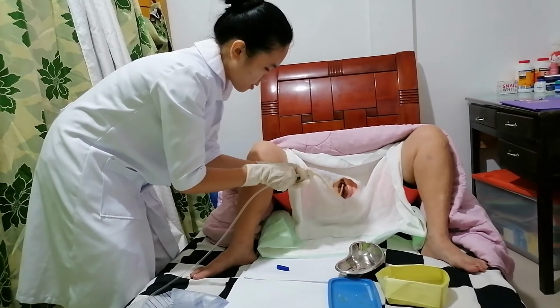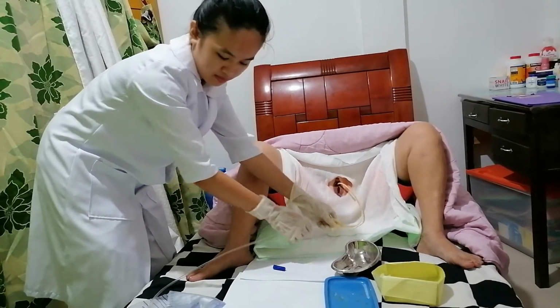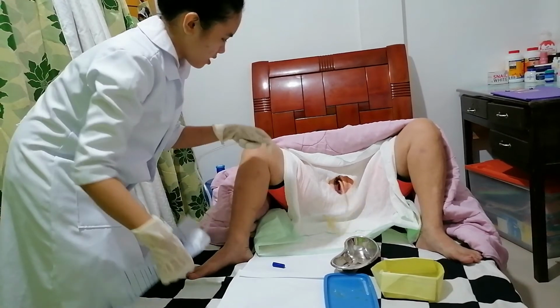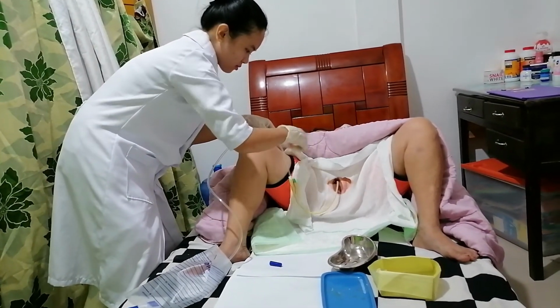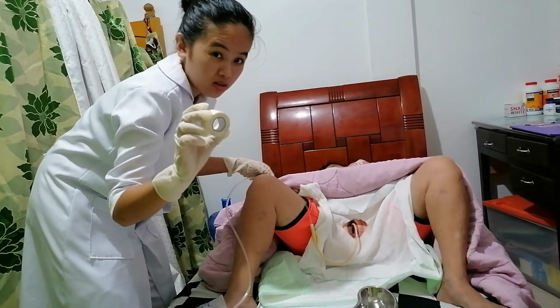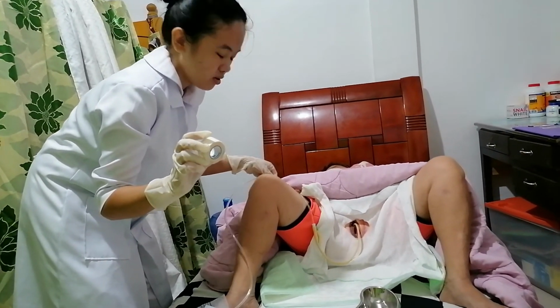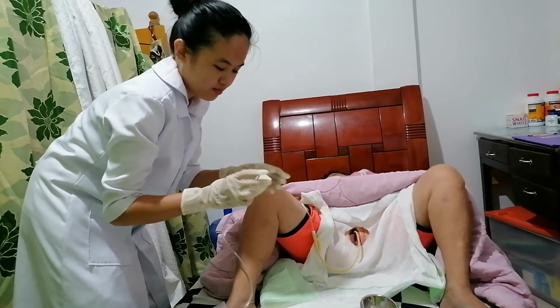Kumusta ma'am? Dili sakit ma'am? Tama naman ma'am. Ma'am, ibutang na ko ni urinary bag diri ma'am ha. So using this plaster or marker, I'm going to attach the urinary bag here beside the vagina.